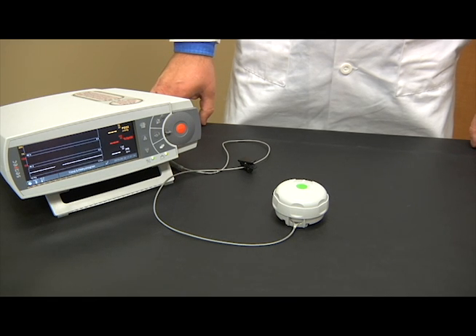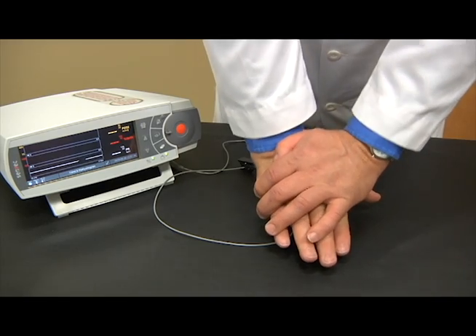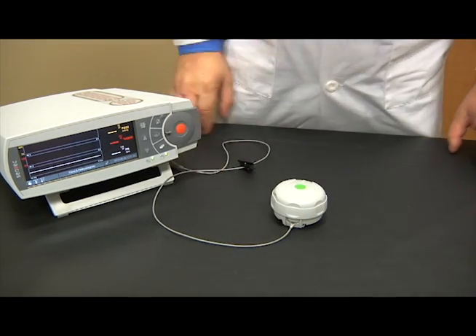Repeat the process of gripping the bottom portion of the membrane changer in one hand and the top in the other. Turn the top in a clockwise direction to the third station. Push down firmly and hold for three seconds. This process applies new electrolyte to the sensor head.